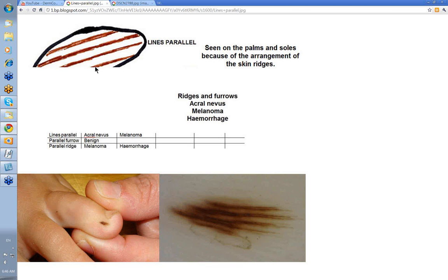The two terms you have to know are furrows and ridges. Ridges are usually the clear thickened area in between, and the pigment is usually in furrows. This is the classic benign distribution: pigment in the narrow furrows and clear ridges, and usually the ridges have little white dots along them representing the openings of the eccrine ducts.